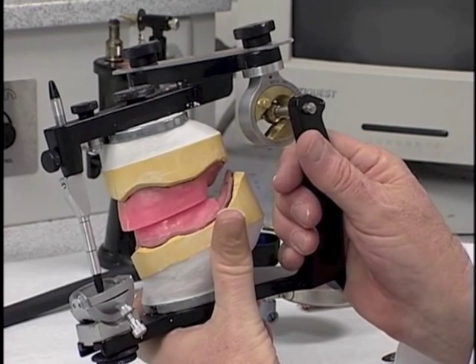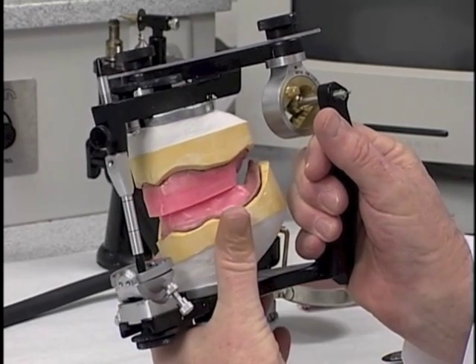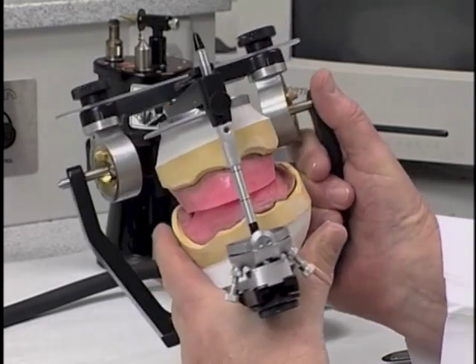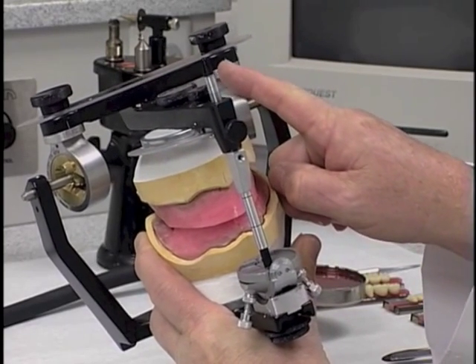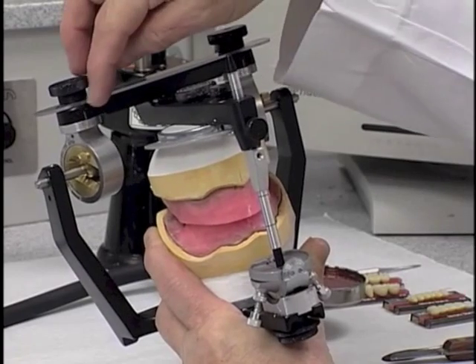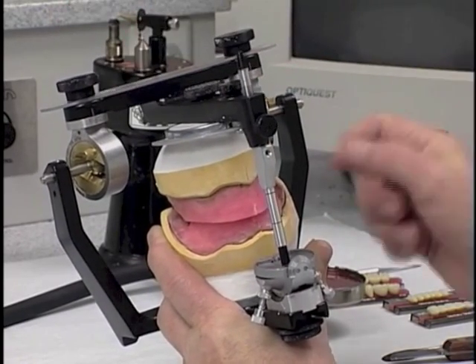From that, using the formula that Rudolph Hanna developed, L equals H over 8 plus 12, that gave us the lateral settings on the condyles, and that turns out to be about 15 degrees on either side.